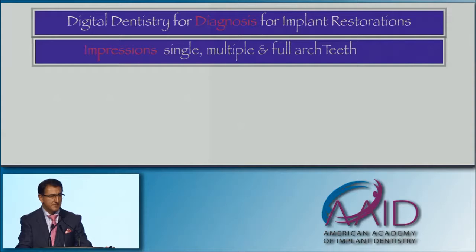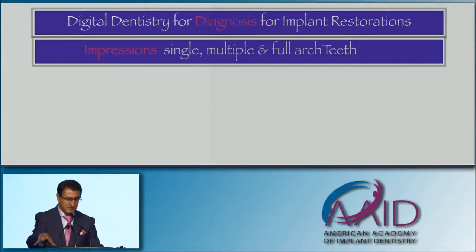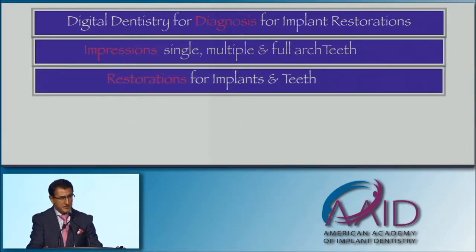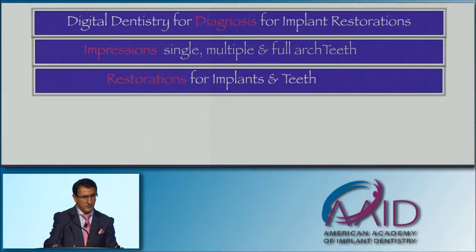A patient comes in for a new patient treatment, for a consultation, we're digitally scanning them. We're digitally doing our radiography, we're taking our CT scans. We're doing all that digital workup of that new patient on a daily basis. Then we're going to take our impressions if we need to. We can take impressions and replace our alginates. We can take impressions and replace our PVS impressions. So we're trying to do as much as we can.